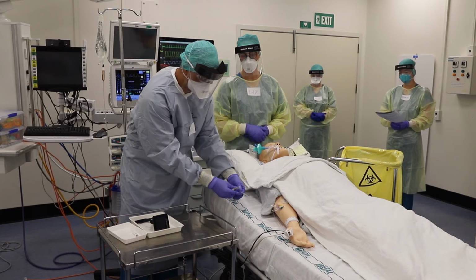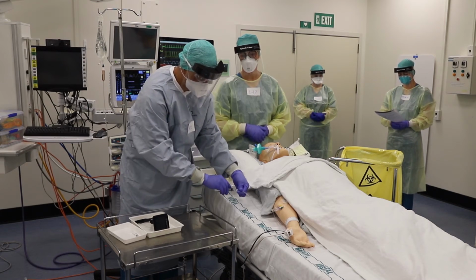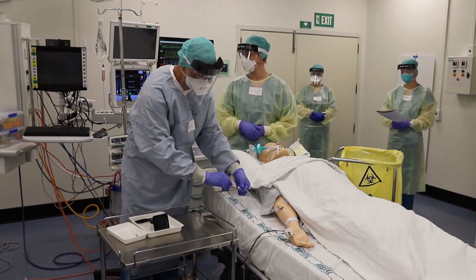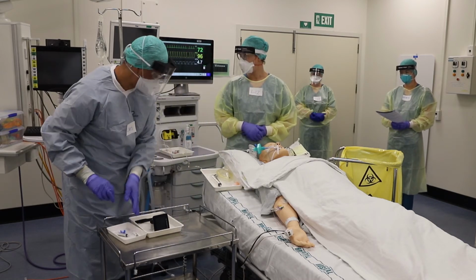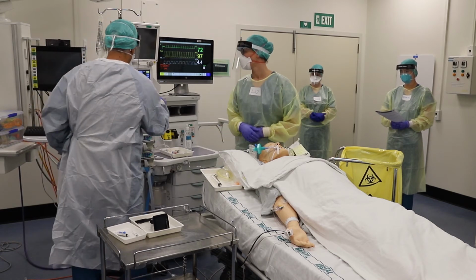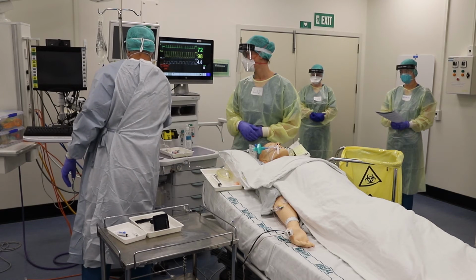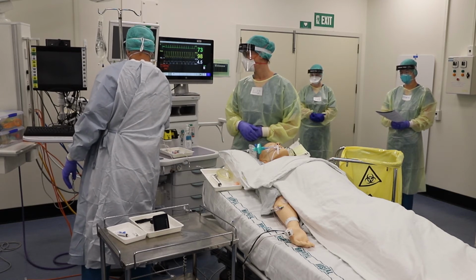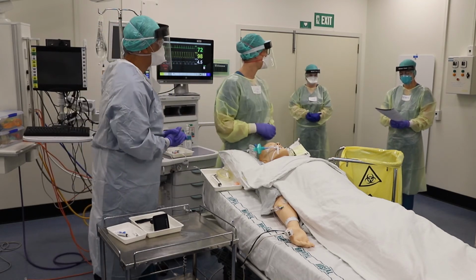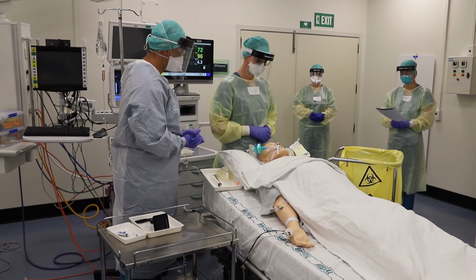Lignocaine. Attached to the line and injecting 5 mils, wasn't it? Yes, please. So 5 mils going in. Ensuring that the drip is running. Yeah. Opening the drip, doctor. And running. So the sevoflurane is off. Great. So 10 litres and 100% oxygen. Fantastic. Confirmed. Okay, Catherine. Anaesthetist, remove eye tapes and tie from ET tube.